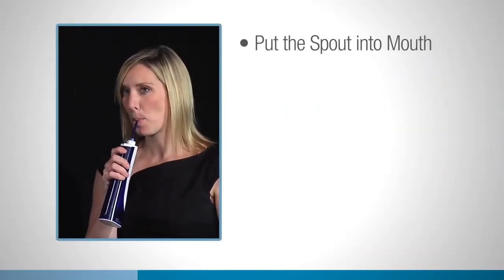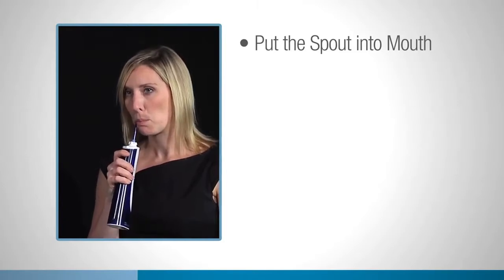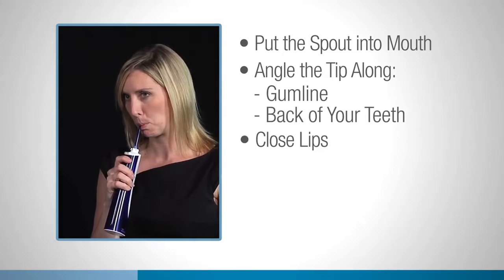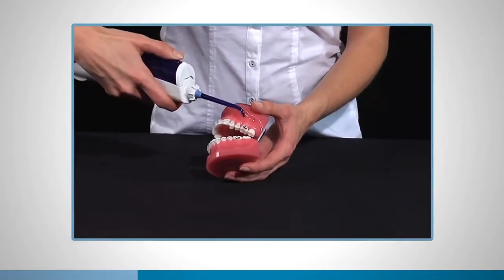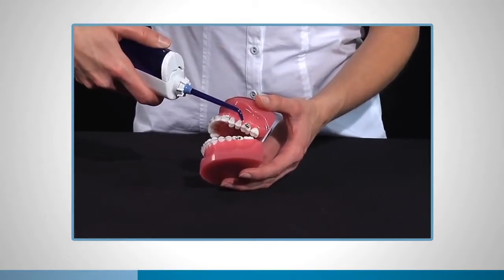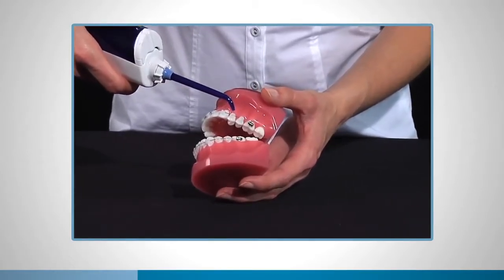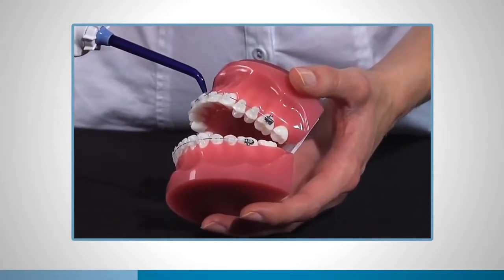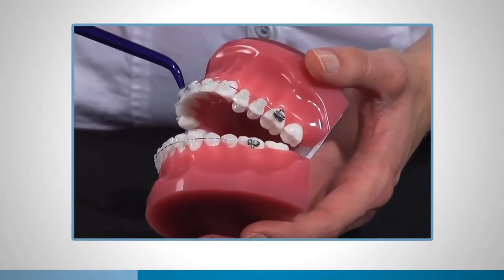When you're ready, put the spout of the water flosser in your mouth. Angle the tip along your gum line, along the back of your teeth, and close your lips. If you don't, the water may spray. Choose a starting point in your mouth that is comfortable for you and turn on the water flosser. Move the angled head along your gum line to ensure you are spraying water in between your teeth and where your teeth meet your gums, both in front and behind your teeth. Ensure not to point down into the gums. It could cause gum damage.